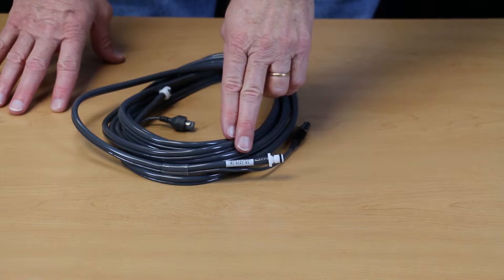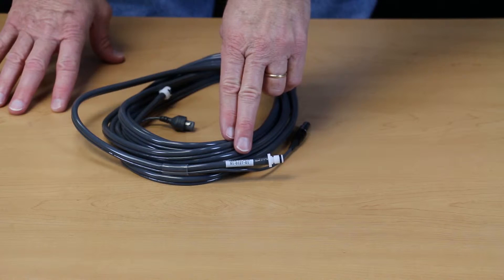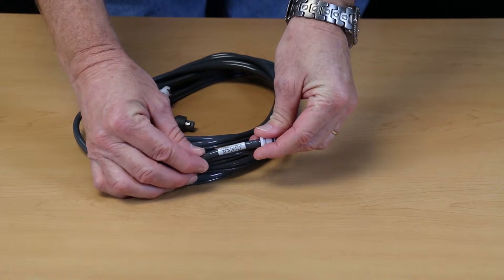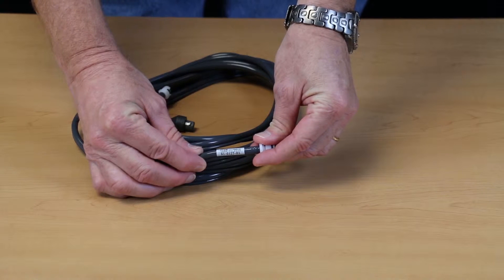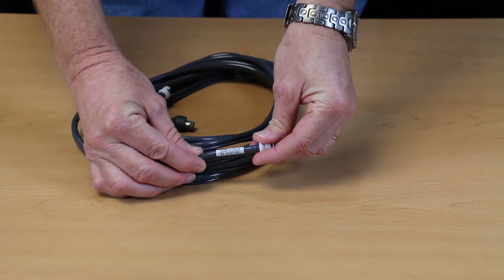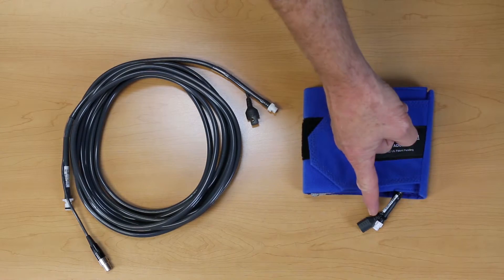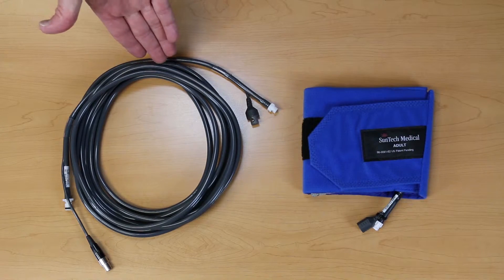For the patient cable, look at the end nearest the pneumatic connector for the date code label. If the patient cable is more than a year old, or if you are not able to read the date due to continuous cleaning, it's time to replace your patient cable. Replacing these items every year will ensure that your Tango M2 is performing in top condition.